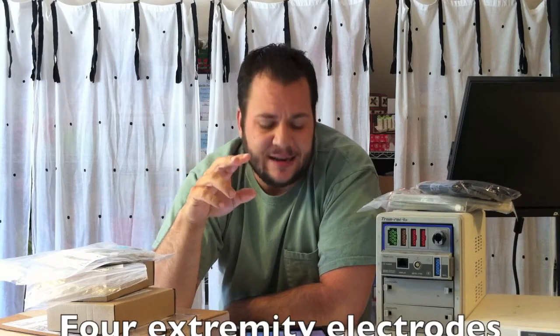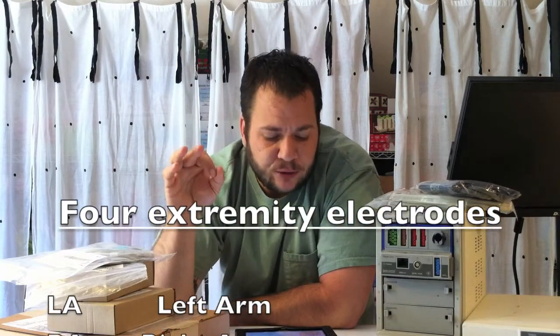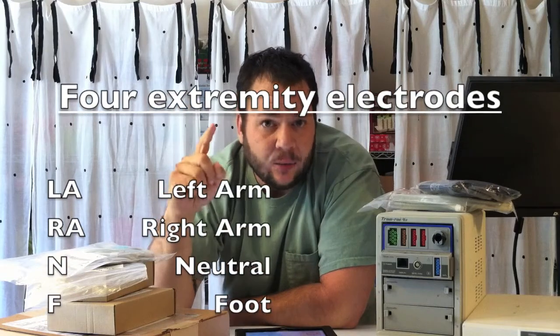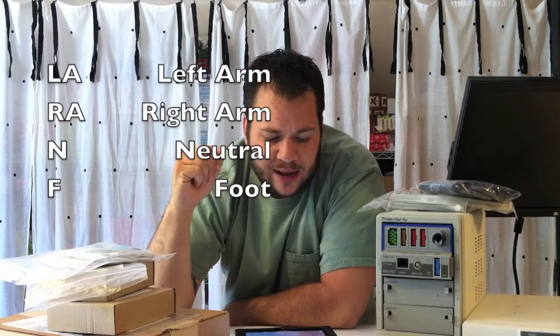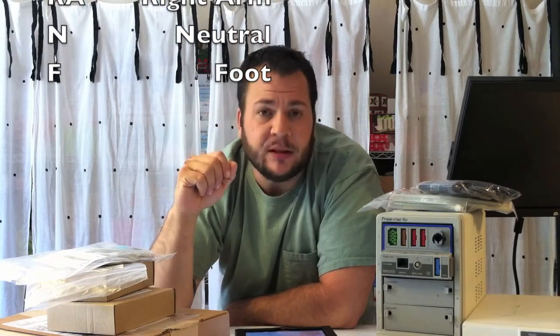Those 10 electrodes are divided into two categories. The four extremity electrodes, which are LA (left arm), RA (right arm), N (neutral), which typically goes on the right leg, or F (foot), which typically goes on the left leg. The six chest electrodes go in order of V1, V2, V3, V4, V5, and V6.